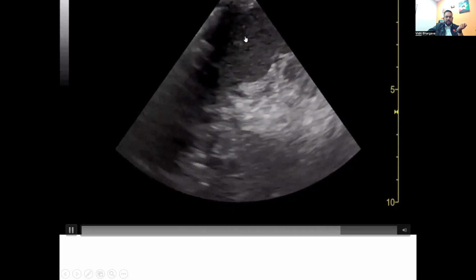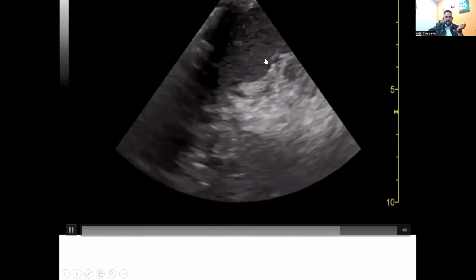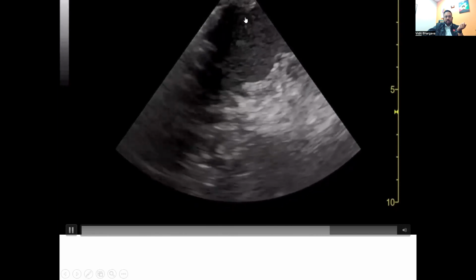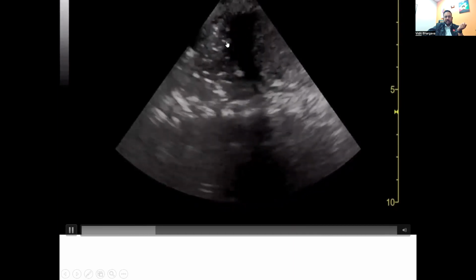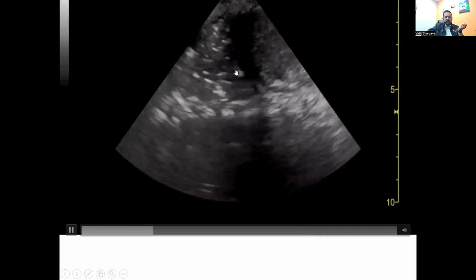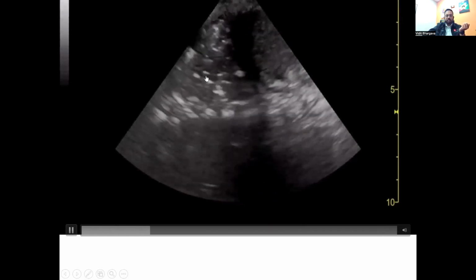And then this is the lung ultrasound from the other side. This is the more traditional left upper quadrant view, where you can see the spine sign. You can see pretty dense air bronchograms, collapsed lungs. There's the spleen right there, but obviously no big pleural effusion or fluid collection.